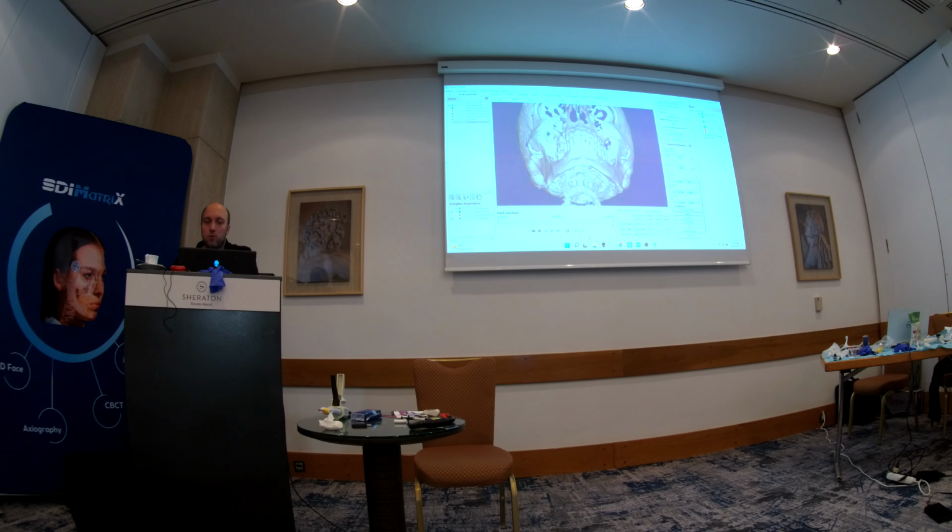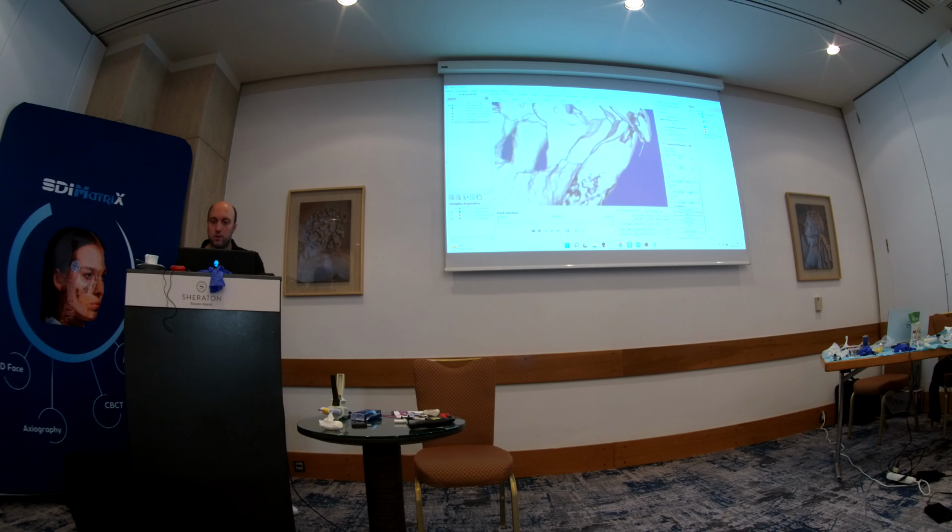For that, in the right menu you can correct the CBCT range, the range on X. We cut the CBCT along the interincisal line, rotate it, and here we see the incisal edge of the lower incisors. On the incisal edge, we put a point.